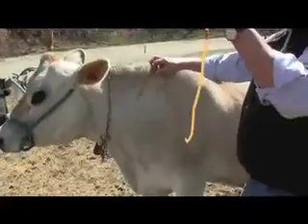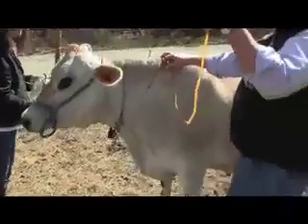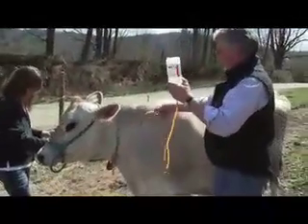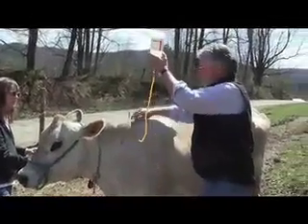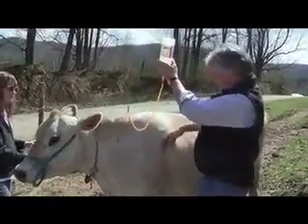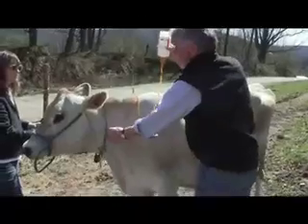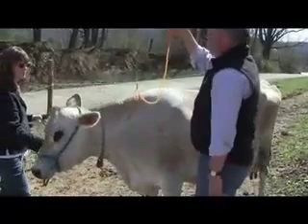There are different techniques and ways of doing this. Some people like to put it in the shoulder. I prefer the neck just because the skin is looser. Some people will do it here as well. But you want to do it where the skin is loose so there's plenty of room for the calcium.